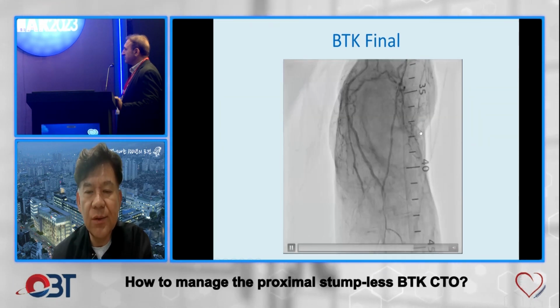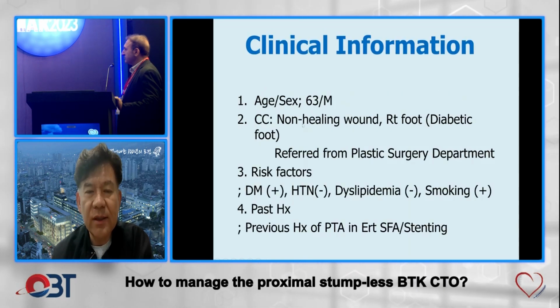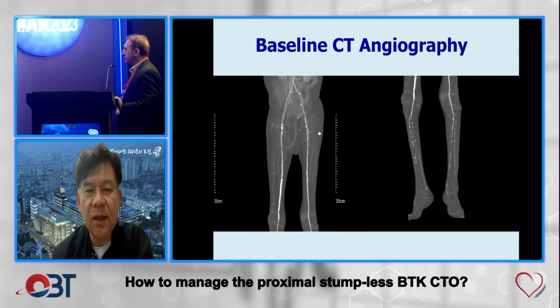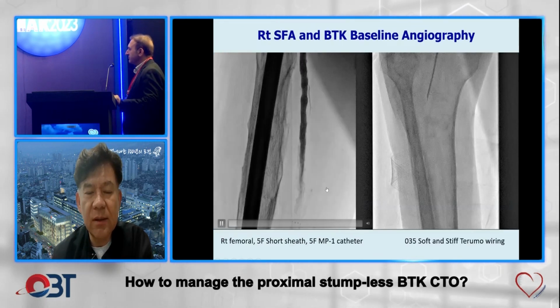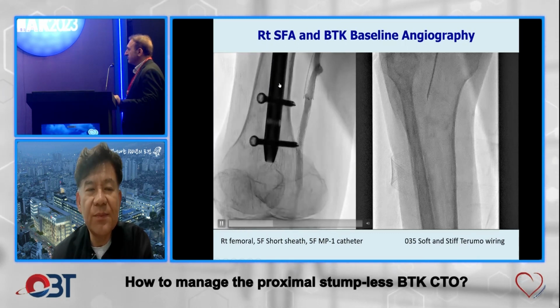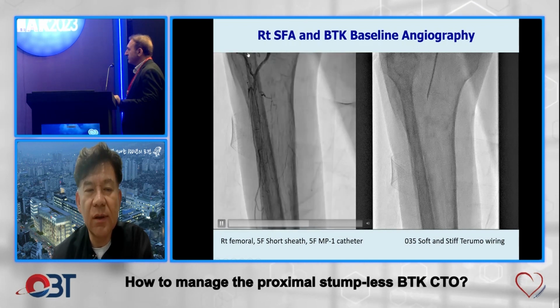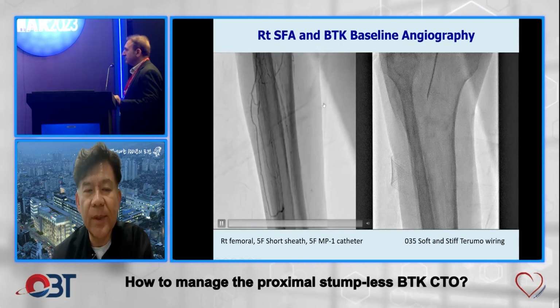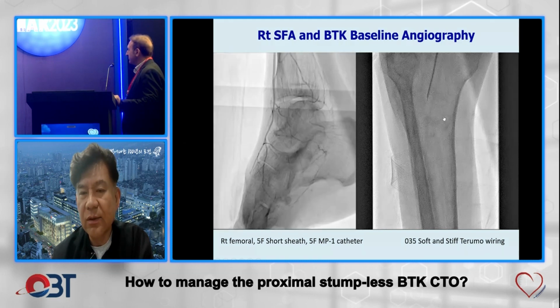We can get many clues from the angiography and the CT. Okay, just a short presentation of this second case. This is a similar SFA stented patient, critical ischemia, with a TP trunk CTO and ATA stump CTO, no information, only one transcollateral route to distal PTA.